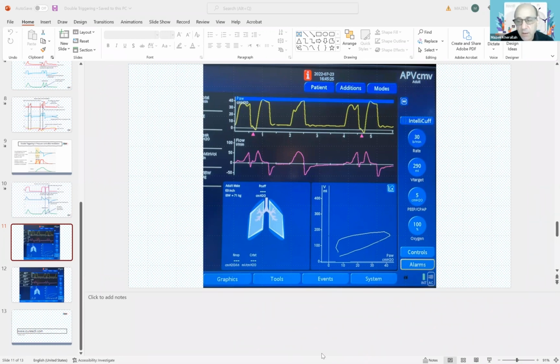Reverse triggering is contraction of when you deliver the breath. Okay. So let's see the first one, whether it's triggered by the ventilator or triggered by the patient. Okay. The patient stops his inspiratory effort. However, because of the inspiratory volume, you're stretching or you're pushing on the diaphragm, it contracted again. And that caused another breath.